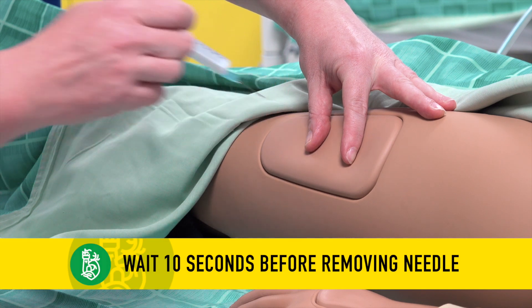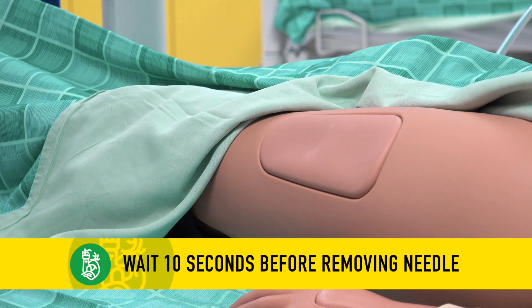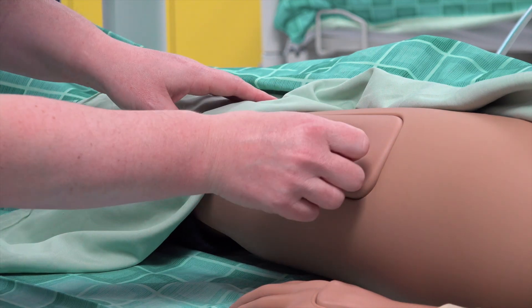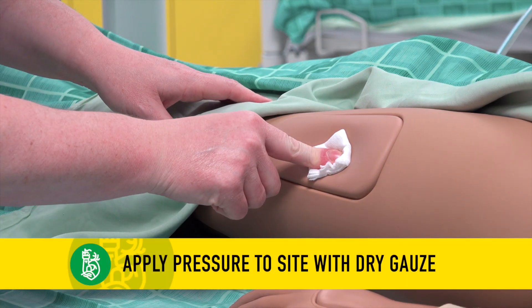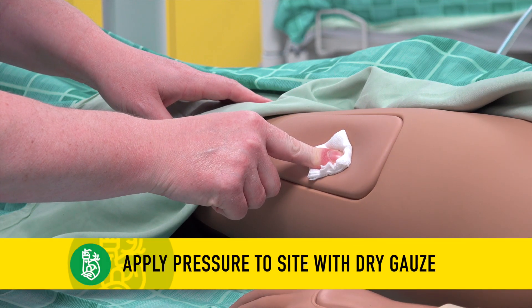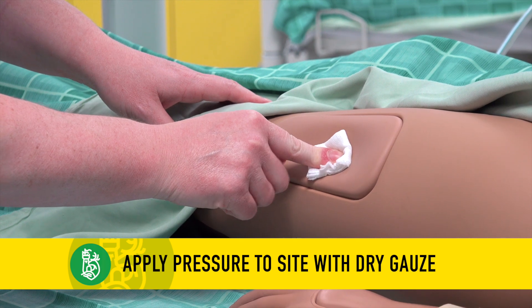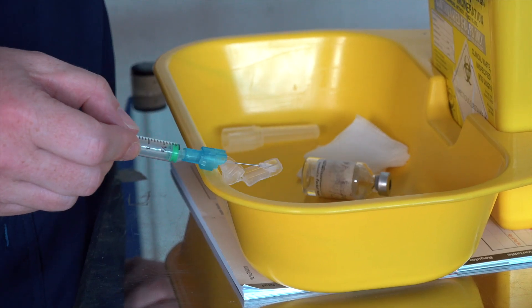Wait 10 seconds before withdrawing the needle to allow dispersion of the drug. Remove the needle and allow the skin to return to its normal position, allowing the drug to remain in the muscle.